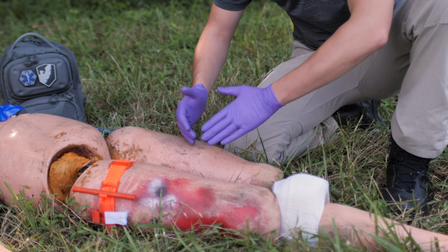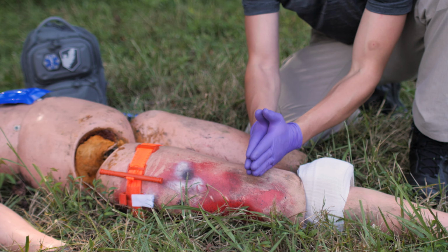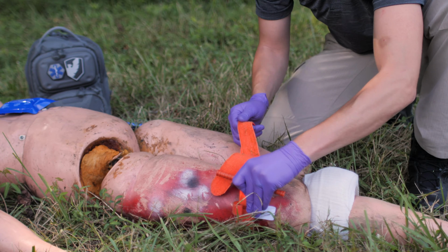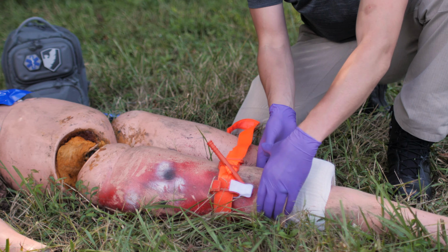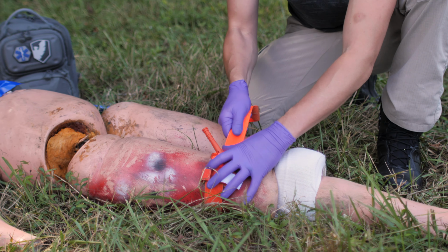Now, the last thing we want to do is we want to take this tourniquet and we want to reposition it down here 2 to 3 inches above the wound, and we're just going to have it loose but in place in case something happens and we have to retighten it. So I'm going to move this down here. It's going to be 2 to 3 inches above the wound, but remember that we can't put it on a joint or on that bone. So we're going to have to go just above that knee joint so that we're actually compressing tissue.